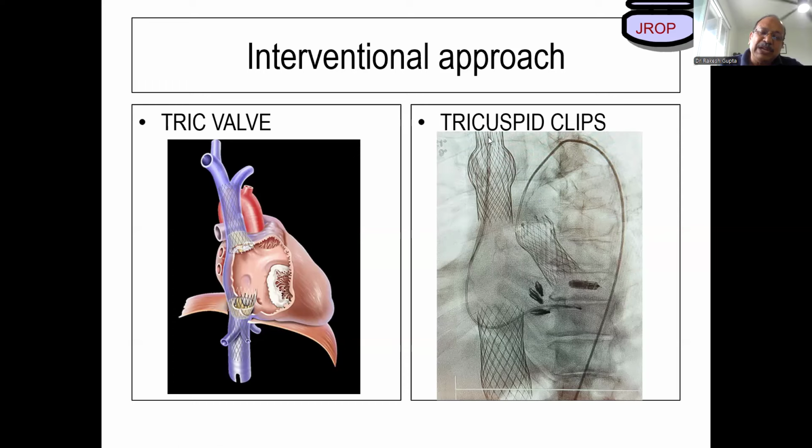So it will only help the blood come from IVC to RA. Reversal of flow will not be seen in this. Similarly, the same thing is put in the IVC. This is SVC, this is IVC. The blood will come from IVC to RA, but the reverse flow will not be seen. Like one-sided flow of blood. Look, the same thing is implanted over here. This is a valve which is implanted into SVC and IVC positions.